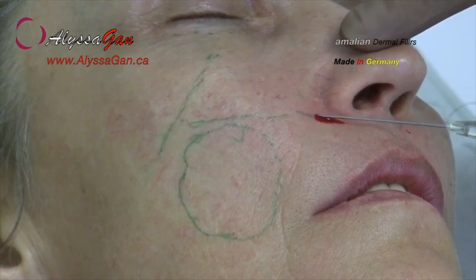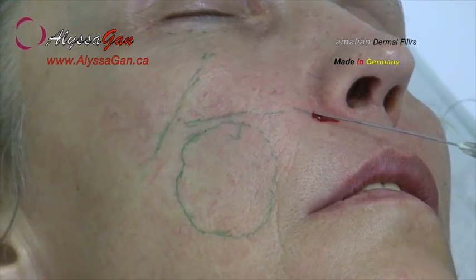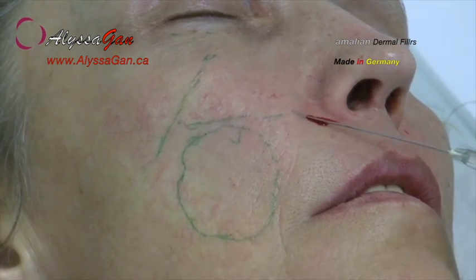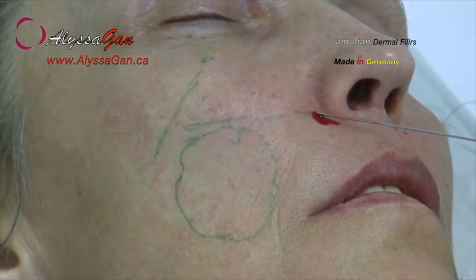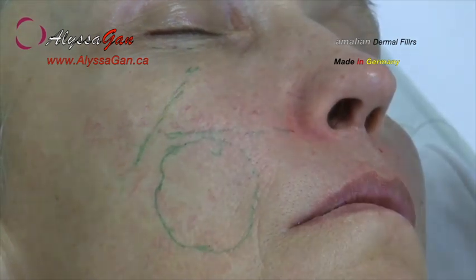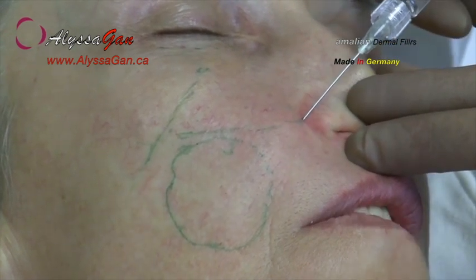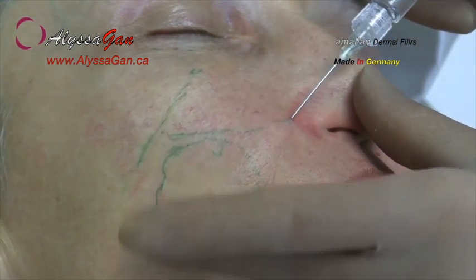The injection is made from the insertion hole at the nose outward, not reversely, because contact with the facial nerve must be avoided, even though a blunt needle with lateral aperture is used. A new insertion hole is used for cheek augmentation. Also in this case, the injection is not made too close to the surface. Palpation with the fingers ensures that the physician has permanent control of the position of the cannula tip.